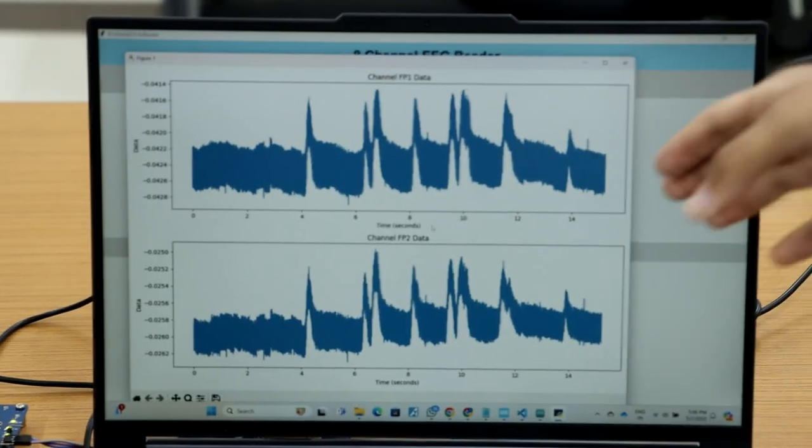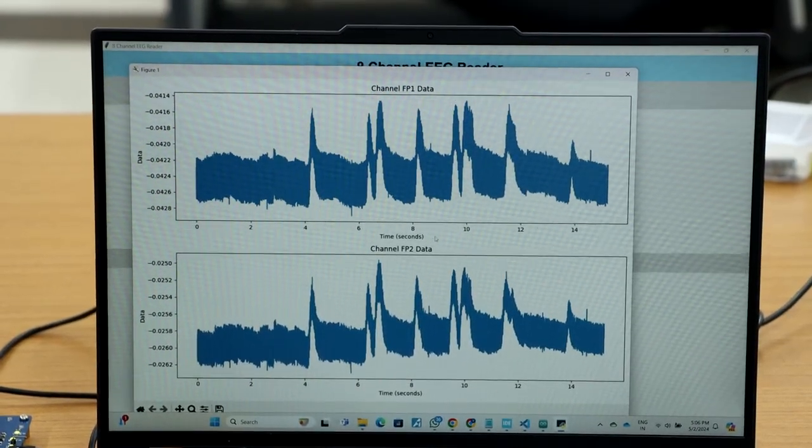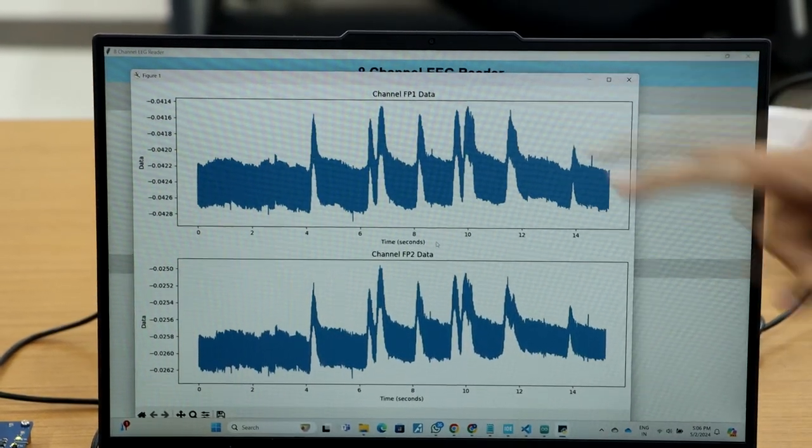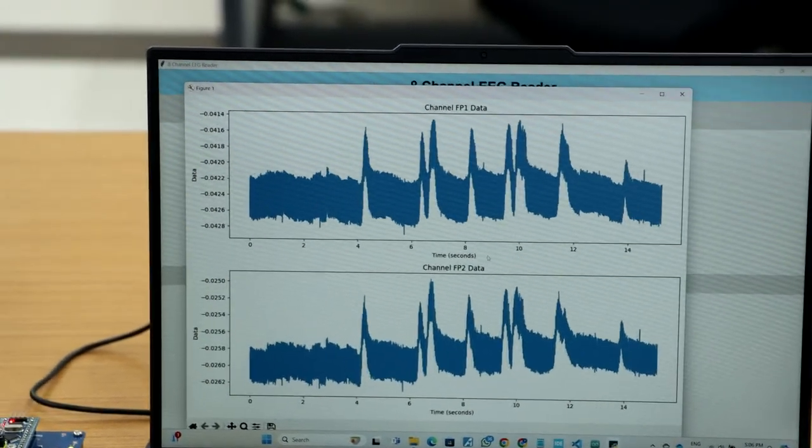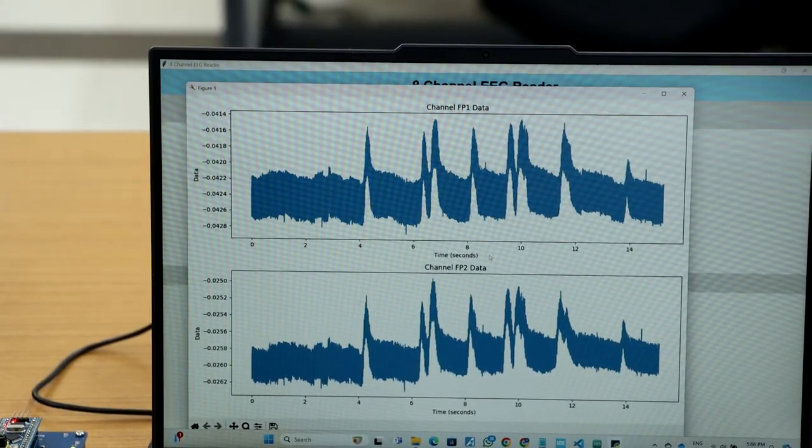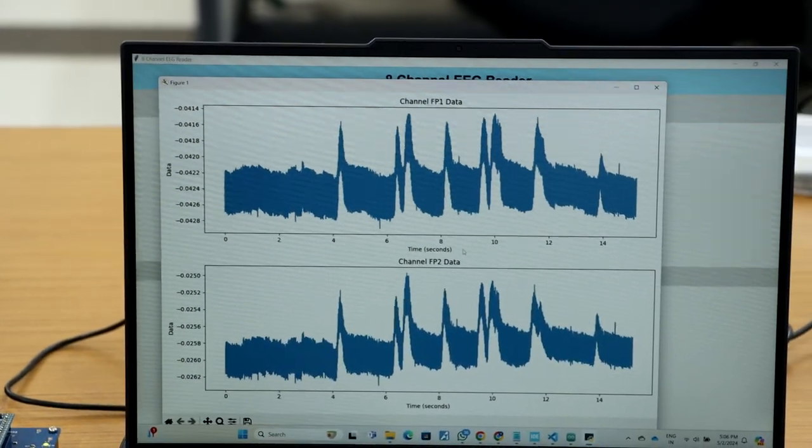Now, the data I acquired is seen as a plot. We can see the peaks when the subject blinks his eyes—the peaks are coming in the plot.